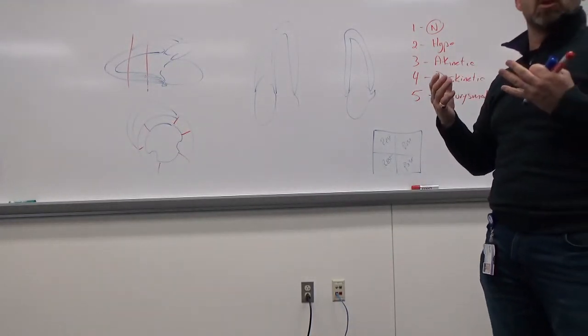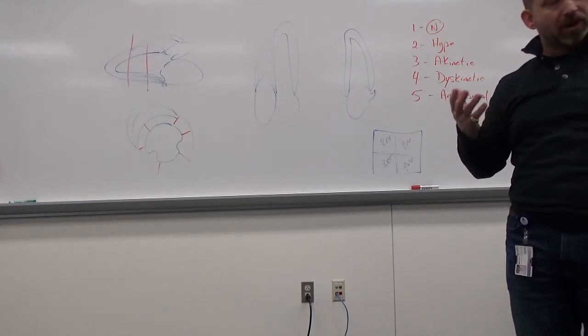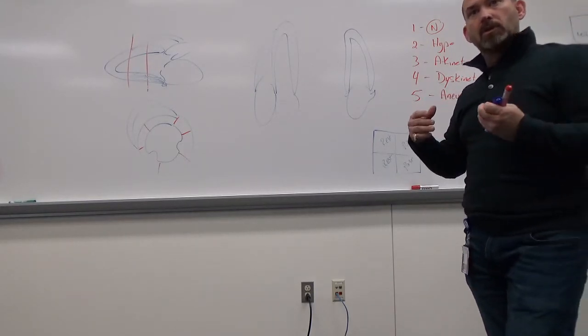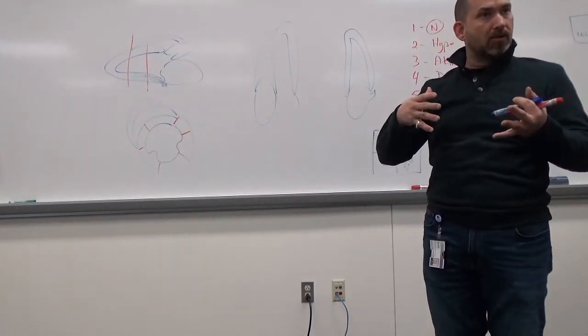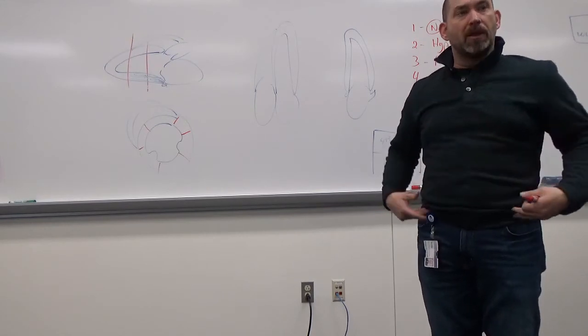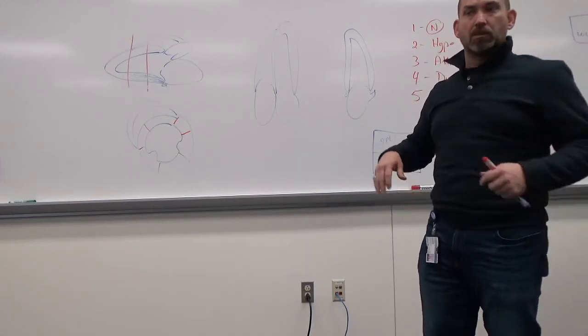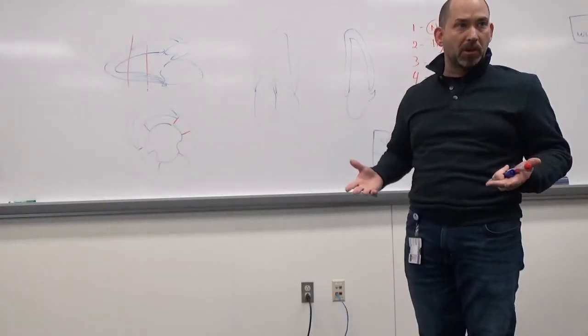So honestly, when you get something that's abnormal with a patient and you can't, by testing, find what's going on, you can sometimes go beyond the mark and try to elicit the situation the patient was experiencing when they had those symptoms. So if I'm looking at a hernia, for example, and I'm laying them flat on a bed and getting them to do Valsalva and all that kind of stuff, nothing happens.